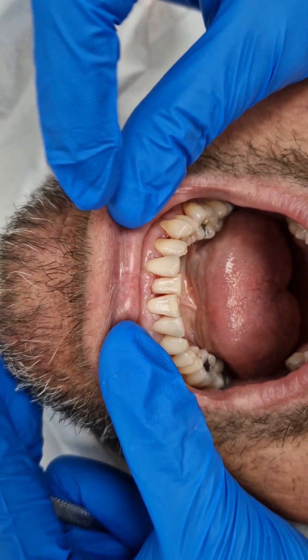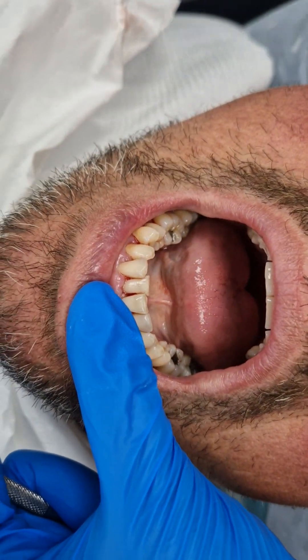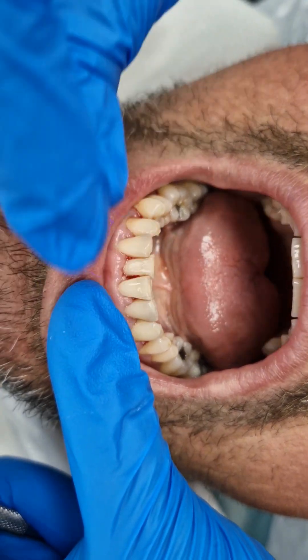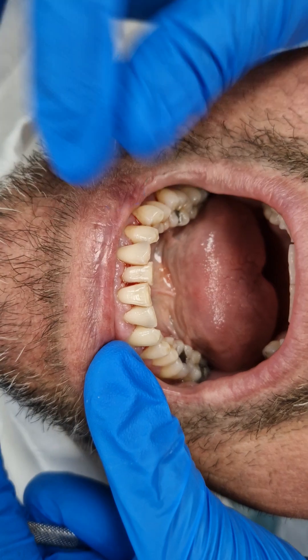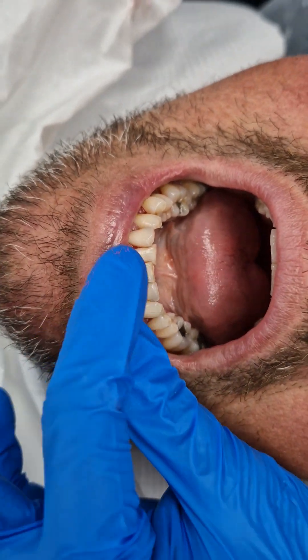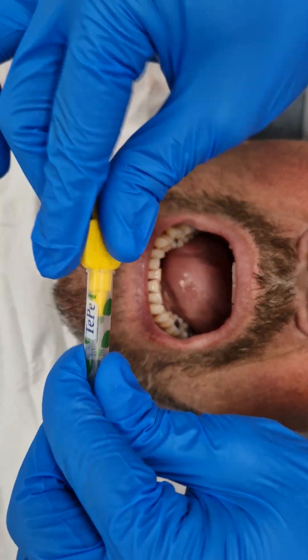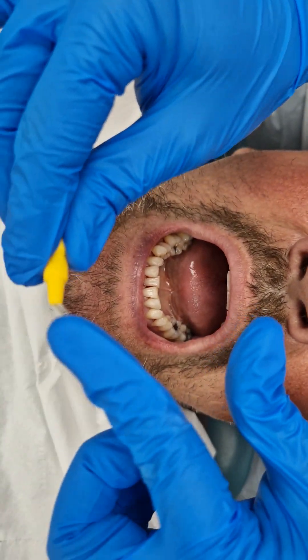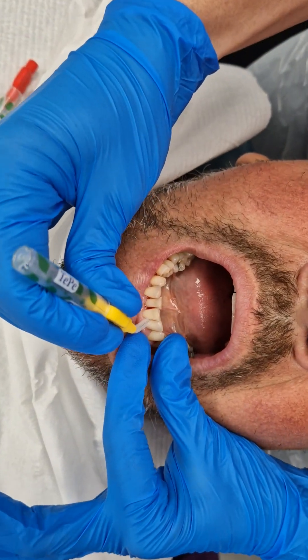After cleaning, we advise patients to use teepees — little interdental brushes — just to push through these sites to keep them clean. The most important thing is choosing the correct colour for the size of the spaces. This is a yellow teepee and you can bend it first to get a good angle. You basically just find the gap and gently push.